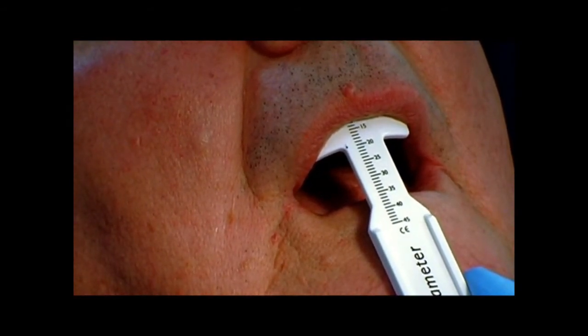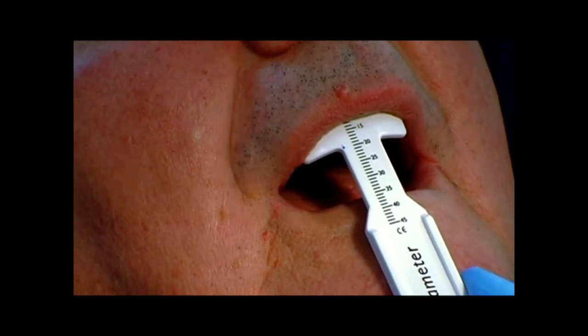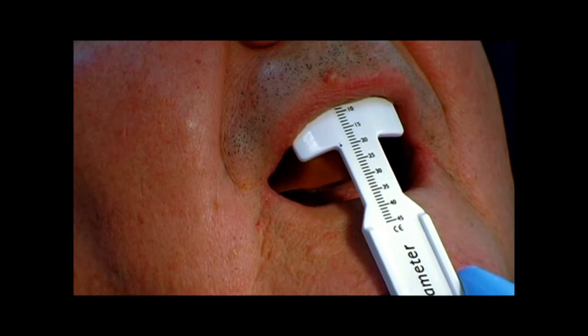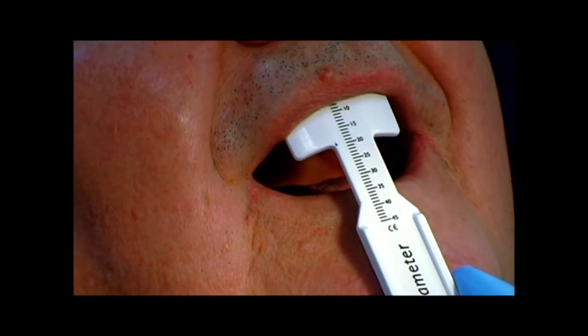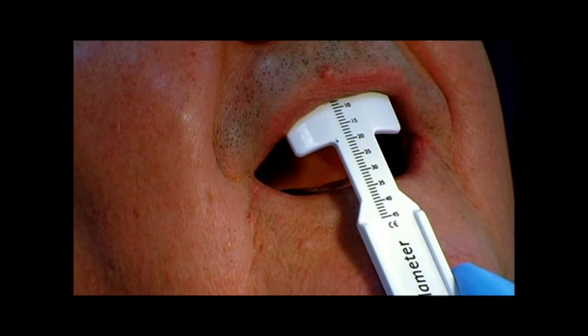That's going to be the patient's low lip line. Now I'm going to ask Mike to give it a nice casual smile. Now we're about 9 millimeters. We're going to consider that as our patient's high lip line. So we've got a difference between low lip line and high lip line of 5 millimeters plus. And give me a little more of a smile, Mike. Maybe I'll put that measurement around 8 millimeters.